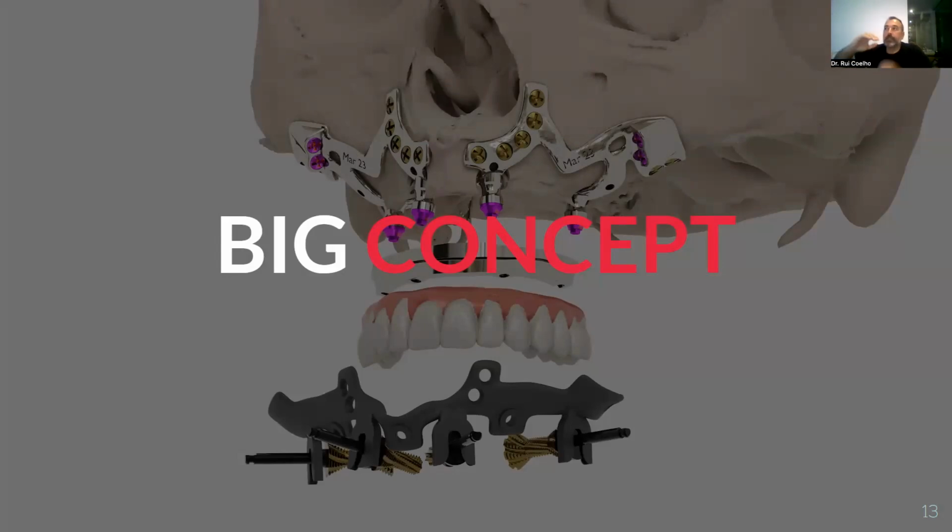This will come to the place where the muscle insertion will occur. So what you have is a flat crest. By having a flat crest, you do not have any chance to have exposure, of course. You can understand that very, very easily.